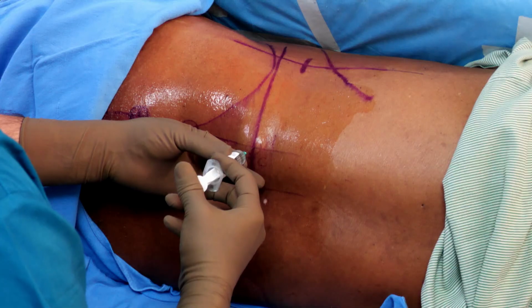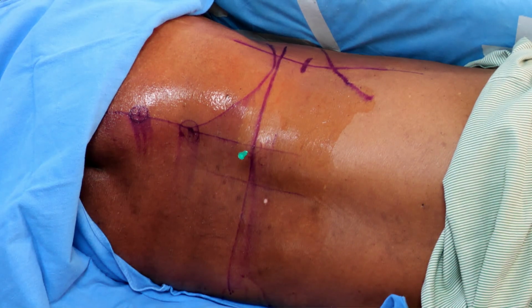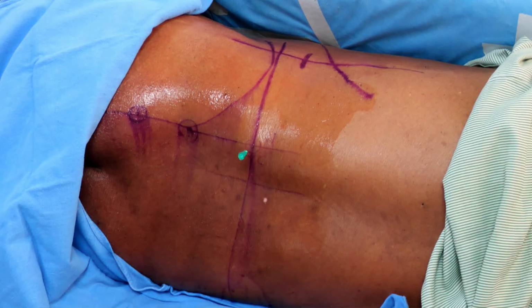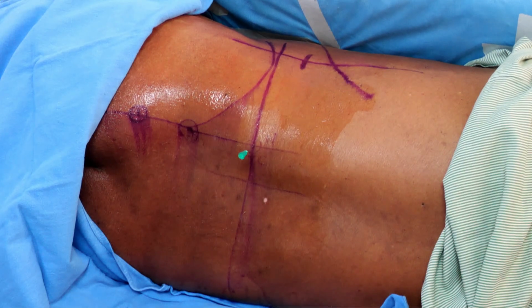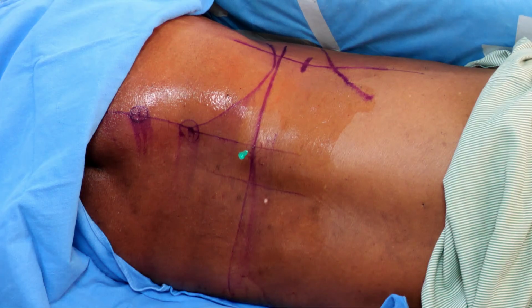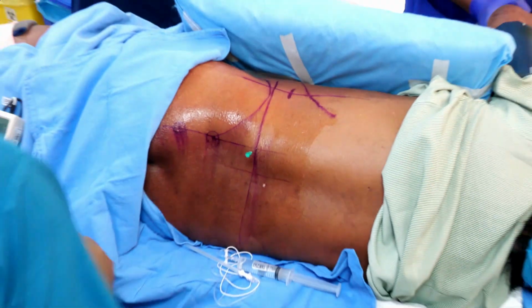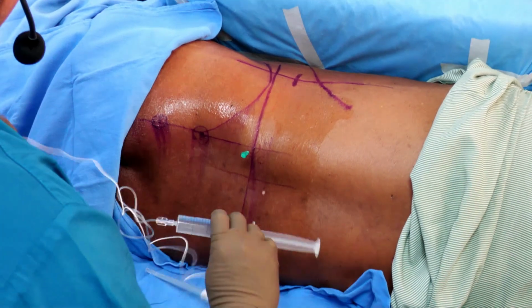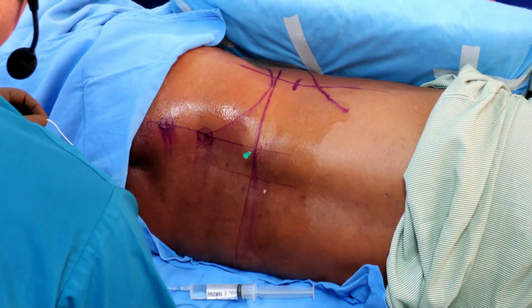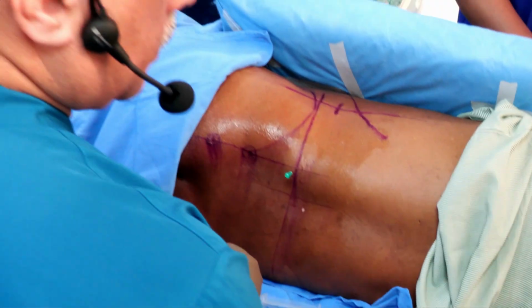Is the concept clear of Capdevilla's point, Winnie's point, till the time they appear? Sir, over to you. So I've already infiltrated lignocaine, though the patient will not require it, because the patient is being anesthetized with remifentanil, already an LMA has been inserted, and no muscle relaxants, of course, and there's some sevoflurane going on.